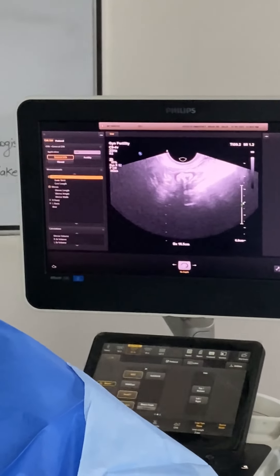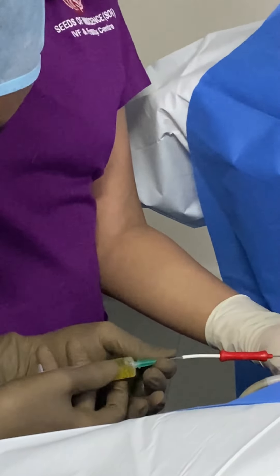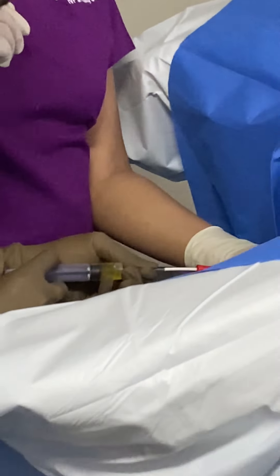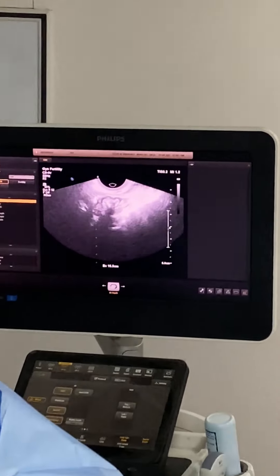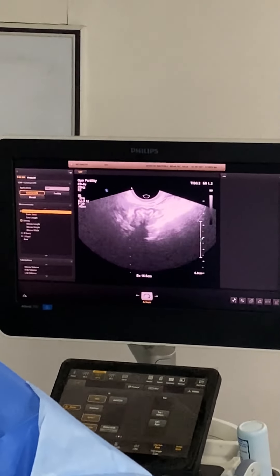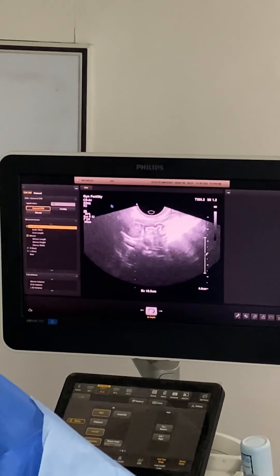We push the PRP into the ovary slowly. We can see the fluid coming in. We try to inject at four different places within the ovary.